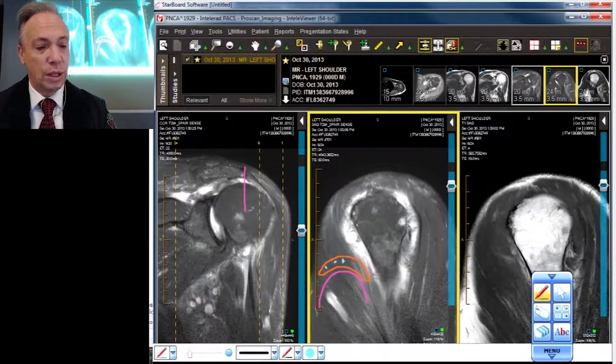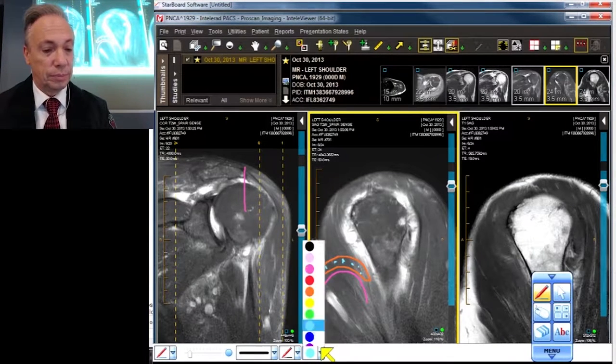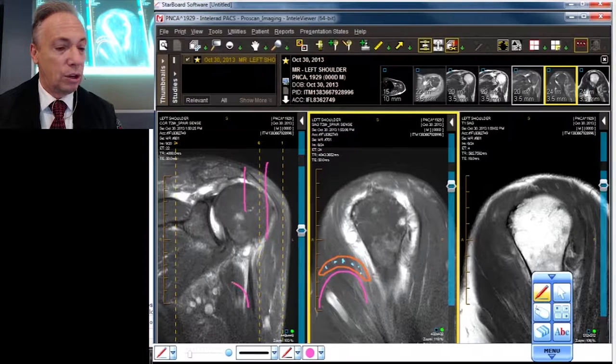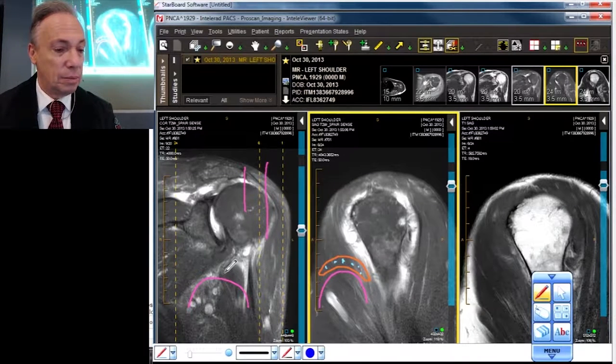Now as we get a little further over — and I'll show you where we are — we're going to pretend we're over here. Then things look a lot different. I'll make a humeral head and what does it look like now? Things flatten out and they become much darker.